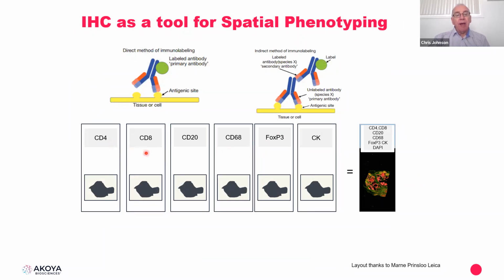So in this particular case, we have 6 biomarkers, which generally require 6 sections to be cut, 6 slides to be stained. Now, the pathologist, or the observer, has to bring the information from each of those slides, coordinate it together so they get a better understanding of the whole overall view. It would be much better, in fact, to be able to have all of those stains on the one slide. And by combining all of these together, this is where we come up with multiplexing.